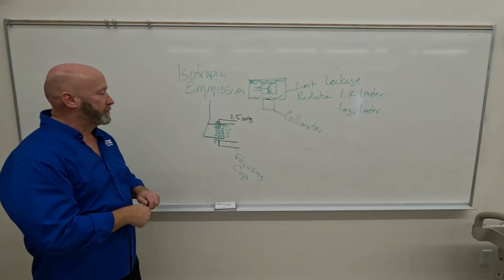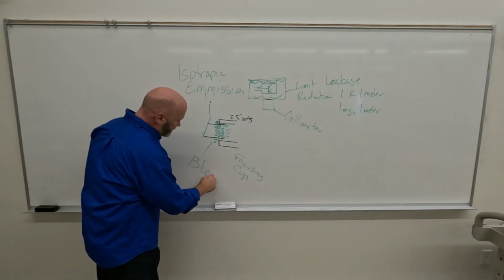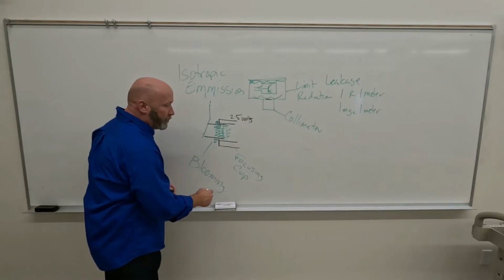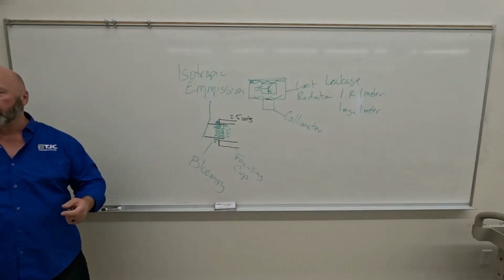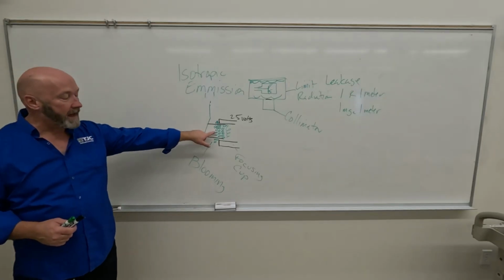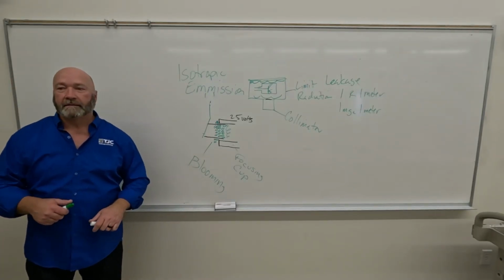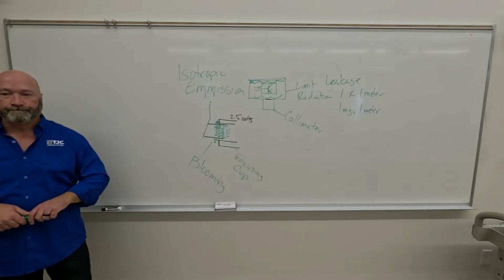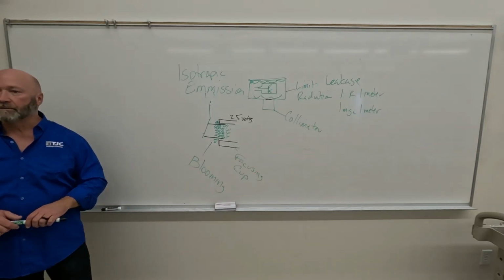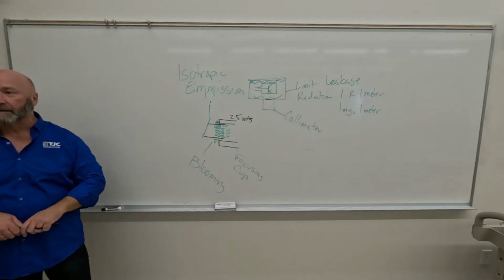It's what we refer to as blooming of the space charge. Just like a flower, it's blooming of the space charge. It gets too big. There's two things that are going to cause that. One is very high MA, and the other is sitting on a rotor button too long. Okay, it's like building up too much. Building up too much, exactly.